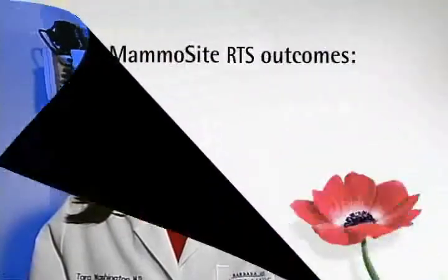Some of the common side effects that people have noticed are, it's possible that the patient may notice some redness and swelling on the skin after the radiation treatment has been delivered. This can sometimes appear within days after the MammoSite treatment is completed, but it is normal for the procedure and it's a temporary side effect that will fade with time.